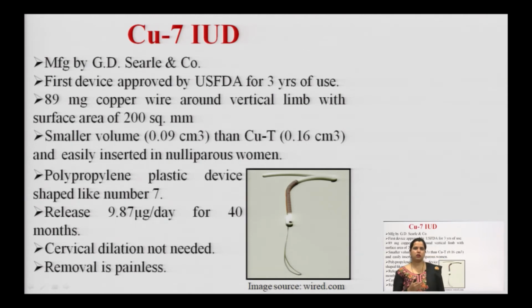Cervical dilation is not needed, and removal is painless. So, this is the description of the copper 7 IUDs.